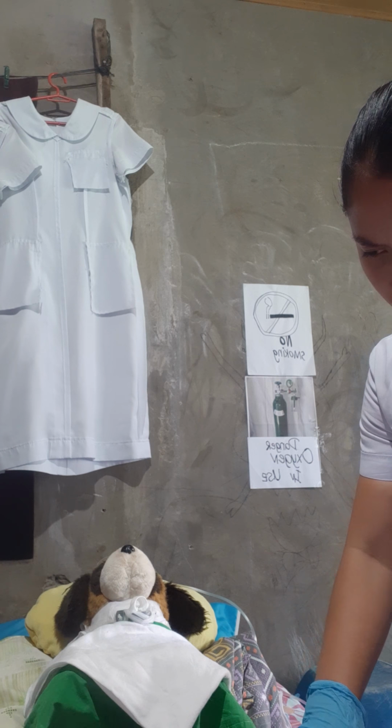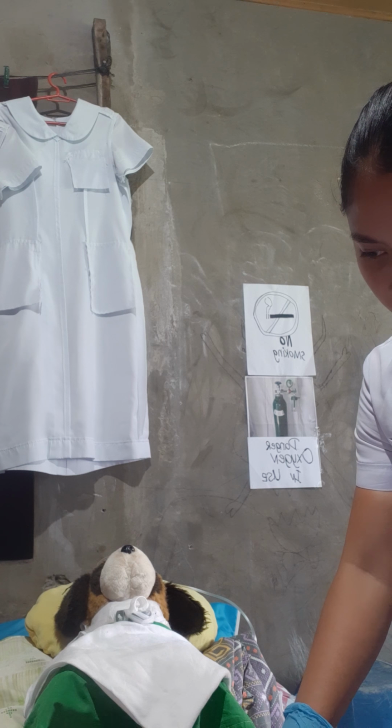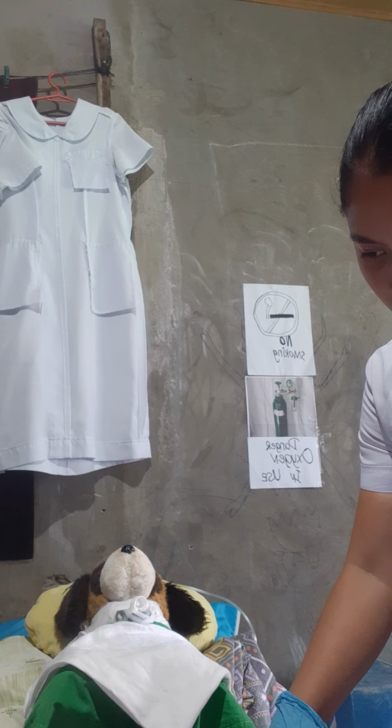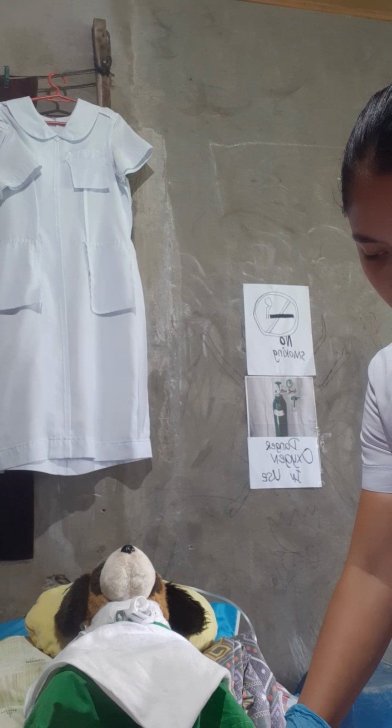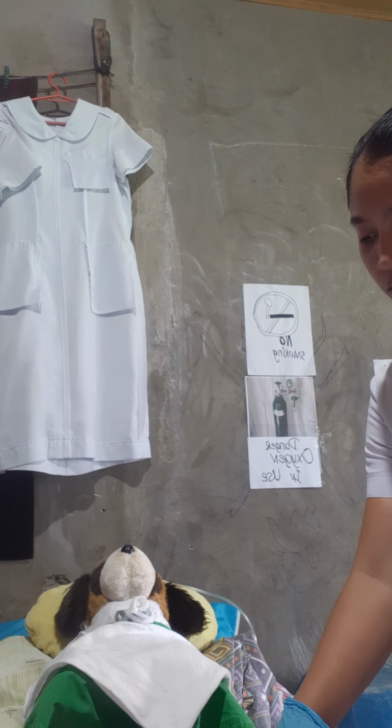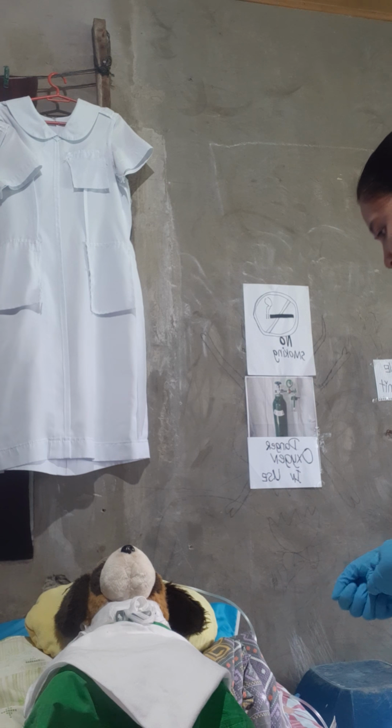Then we're going to replace the oxygen source over the outer cannula. Then remove gloves.